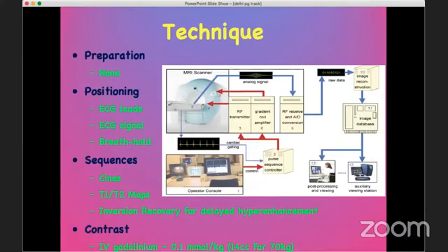There's little or no preparation for a cardiac MR. Patients are not fasting. They usually come with a light breakfast first thing in the morning. For male patients, the chest hair has to be removed, and you need to have a creatinine level. We generally do not do cardiac MR if the GFR is less than 40 because of the serious risk of NSF.